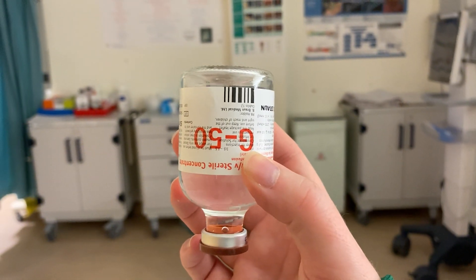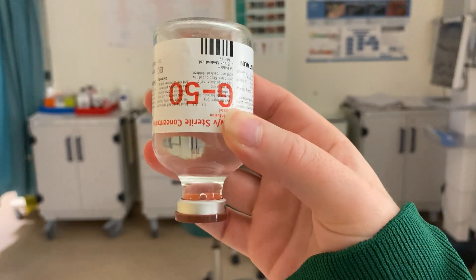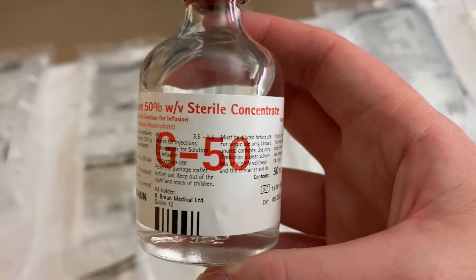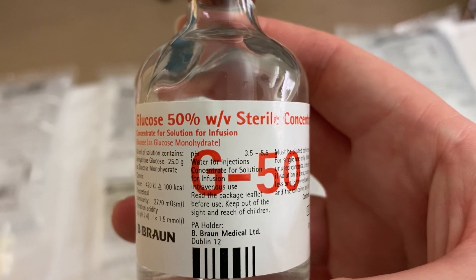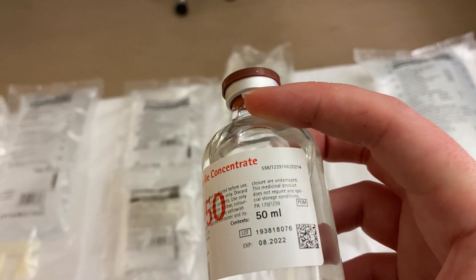Because this is a glass bottle, it can be difficult to drain — insert a wide-bore needle (green or white) into the rubber bung beside the spike to allow air in and let fluid drain via the giving set. To hang it on a drip stand, put a little tape in a loop from one side to the other. That's G50 — which you may use to treat hyperkalaemia. Its pH is 3.5 to 5.5.